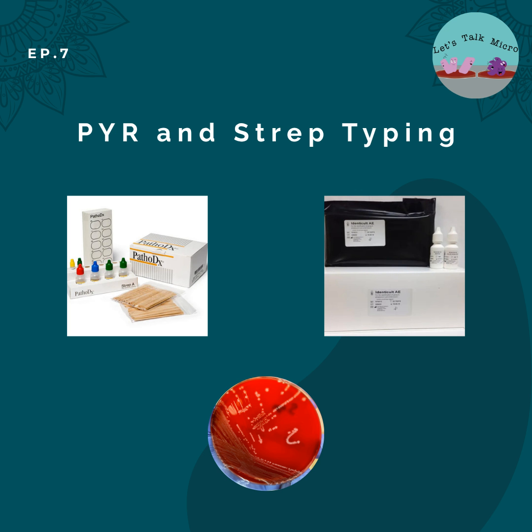But you also have to be careful, because this test is for beta hemolytic strep, right? If you look at the flow chart, I mean, you're a microbiologist, you know that some of these species can exhibit all three types of hemolysis. Streptococcus anginosus, which is called the Streptococcus anginosus group, where you have Strep anginosus, Strep intermedius, and Strep constellatus, can have all three morphologies. They can be alpha, they can be gamma, and they can be beta. But you would only do the typing when they're beta hemolytic. This test is designed for beta hemolytic strep.